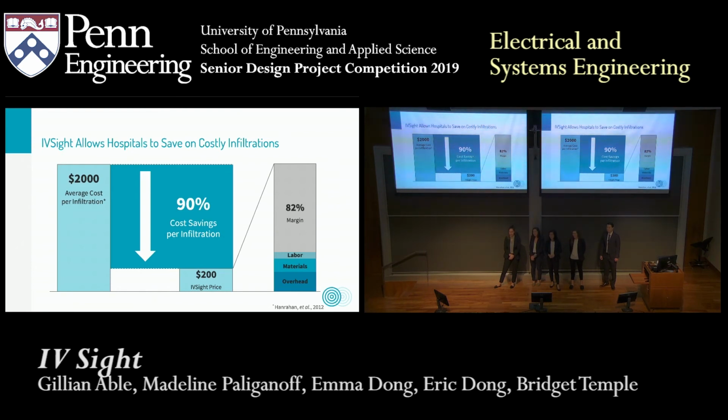So how much training is required on average for a nurse to get proficient with the technology? The training process involved in a new technology goes through a series of steps. First off is a pilot. That's just a couple of days where the nurses, for their 3-day shift per week, are utilizing the device in their hourly rotations. And then from that pilot, those nurses that are trained can use it in their daily bedside routine. So usually around 36 hours of training in their 1 week span in the hospital.